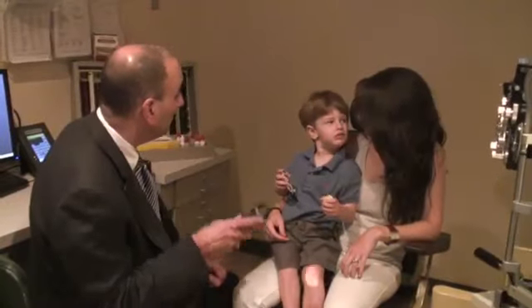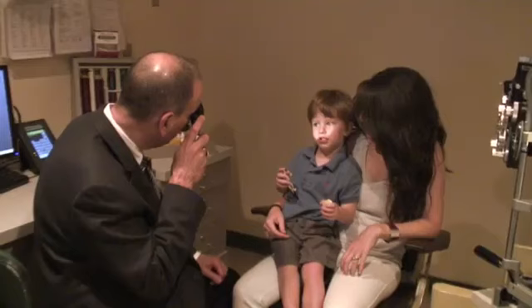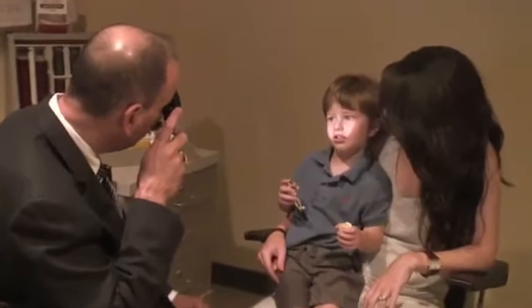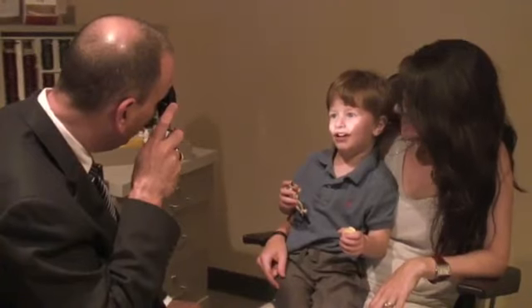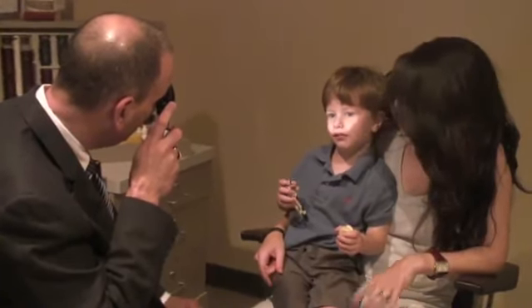Now that you understand the equipment that's used for this test, let's move into an examination room with some children and see how the test is performed. To begin, position yourself approximately 1 meter in front of the child. Using the direct ophthalmoscope, illuminate the child's face so that both eyes are in view. Remember to use your focusing wheel to bring the child's face into focus.